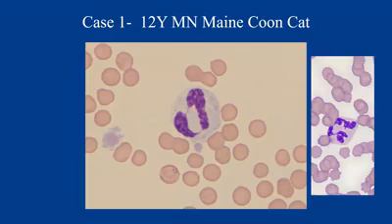So these are some representative images from this patient's blood film. On the right, this is a normal, the best I could do to find a normal cat. We don't have a lot of normal cat blood here because everything seems to be coming in sick lately. But this is a fairly normal segmented neutrophil. A mature segmented neutrophil should have what I call thin nuclear sausage links, with little nuclear bridges connecting the links. And then we've got a nice clumpy nuclear chromatin pattern.